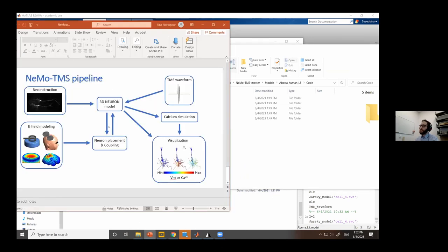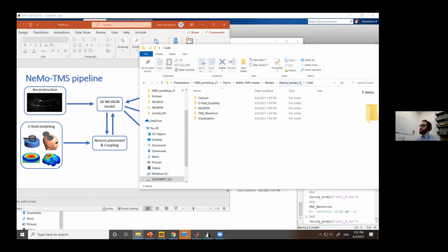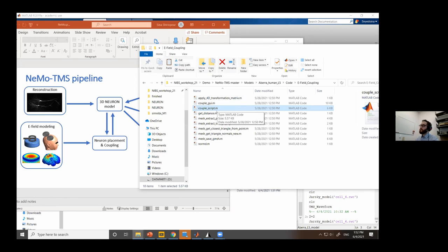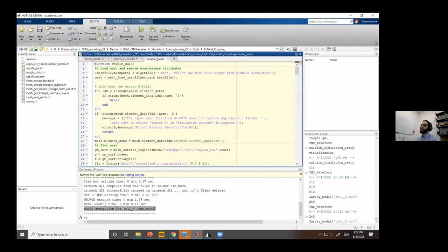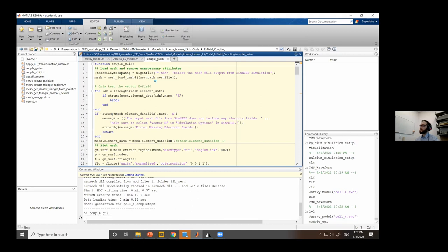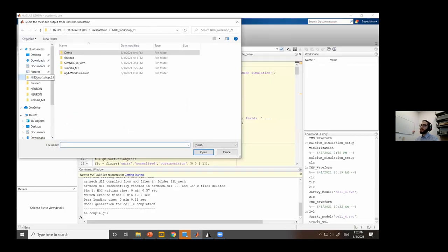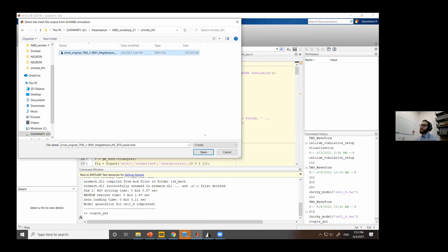Go to code > eField_coupling. You only need 'couple_GUI' or 'couple_script'. I'll show the GUI version today as it walks you through each step in a graphical interface. Change your MATLAB directory to this folder and run the script. First, you select the SimNibs output mesh file. After loading it, MATLAB reads it and displays a 3D plot of the electric field results, asking you where you want to place the neuron.